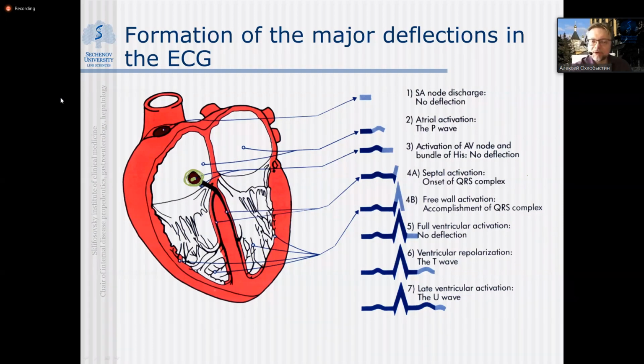From the point of view of ECG, according to the delay, that pause, that interval after P and before the ventricular complex, is due to activation of the AV node. But the point is that not only that time, maybe some extra time will overlap some deflections, and that overlapped portion cannot be recognized in the ECG directly.